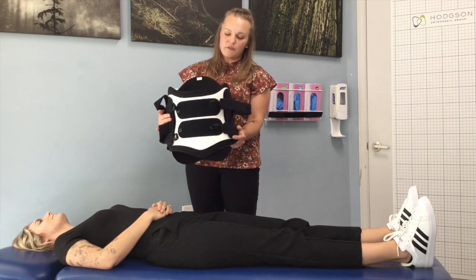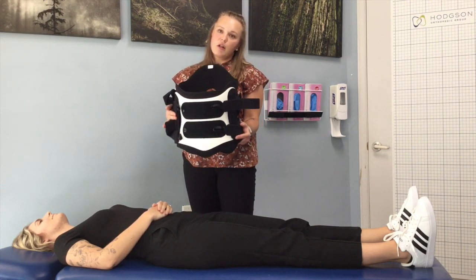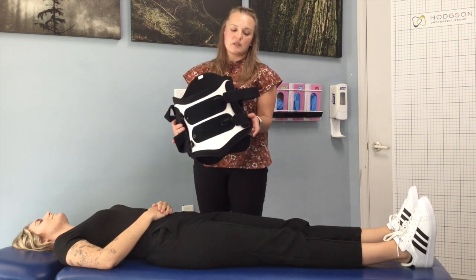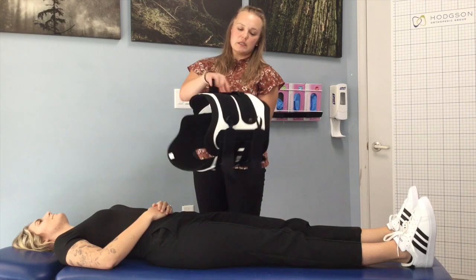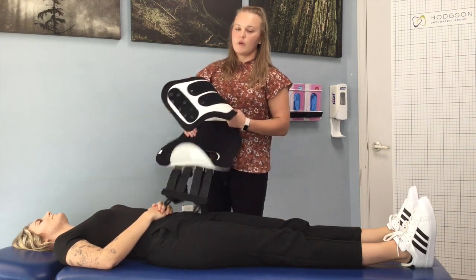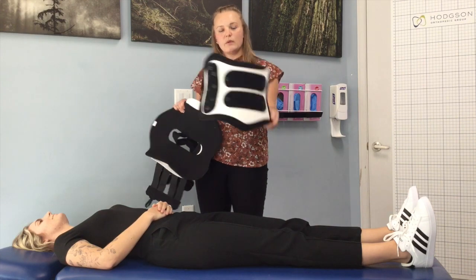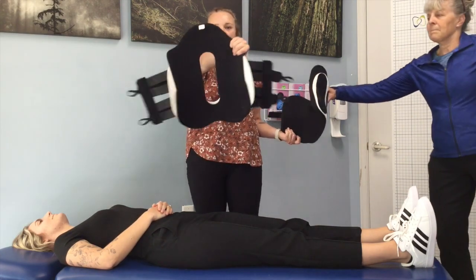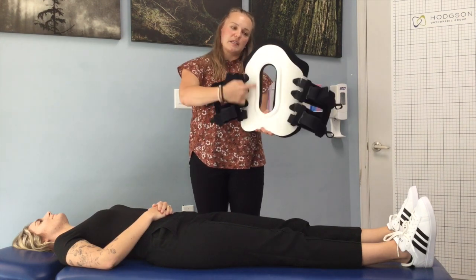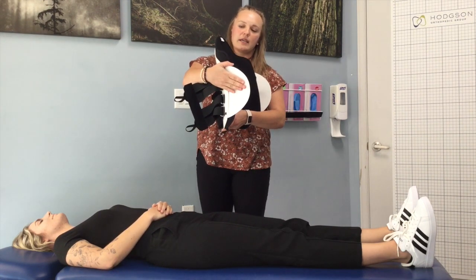We're going to go over donning and doffing. We're going to have our patient roll towards us, and we're going to review another variation of what this brace could look like. So we have an anterior, or what we call a French shell, and we also have a posterior, or a back shell.